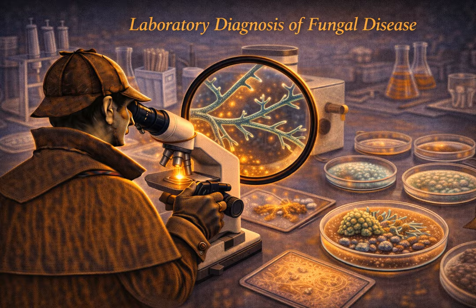Finally, for microscopy, we have the heavy hitters from the pathology lab. The tissue stains. If a biopsy goes to surgical pathology instead of micro, they don't usually do gram stains.